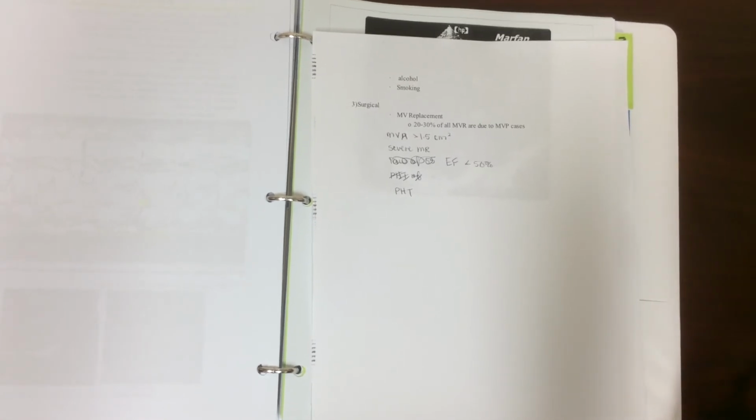You'll know it's necessary to replace the mitral valve when mitral valve area is greater than 1.5 centimeters squared, with an ejection fraction of less than 50%, and again, a pressure of 55 millimeters of mercury.